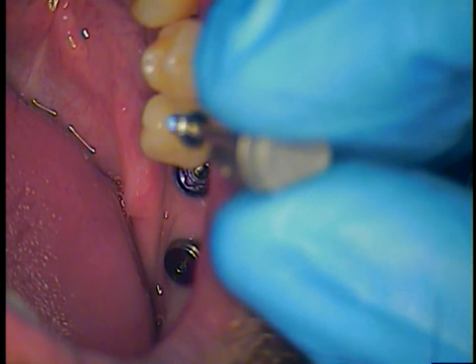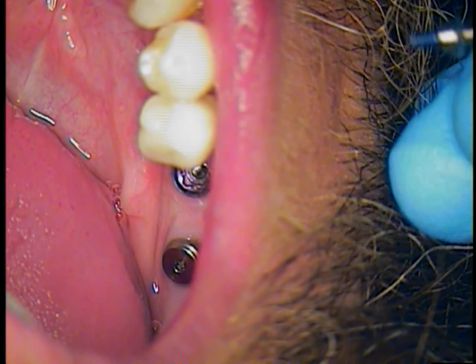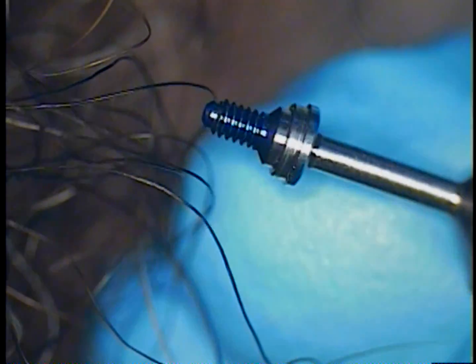We're now at the end. We did finally rethread and tap this fixture. It does have at least seven threads. We know some of the threads are a little nicked here and there, but everything is working. So we're going to try our screw in ever so gently. This is the cover screw, and if you count the number of threads, it's right about seven.